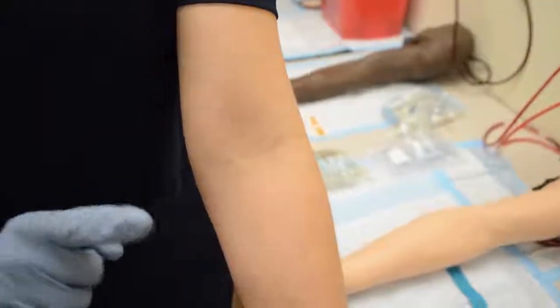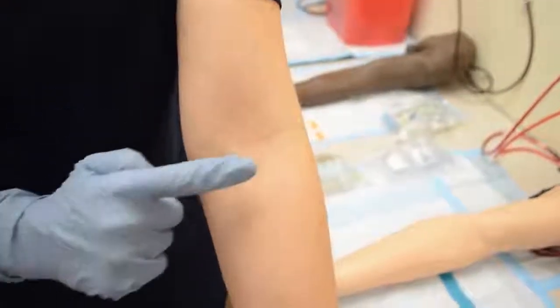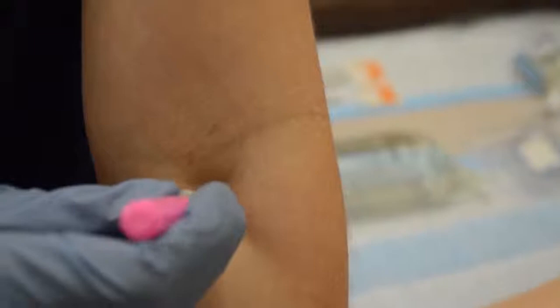Sometimes veins that we cannot see but can feel, we lose after cleaning. So before you clean the site, you can use anything that happens to have any kind of depression in it. What you can do is lightly press it up against the skin and rotate back and forth where you found the best place to poke your patient. When you remove that, you'll have a small raised area that you can clean, and it will still stay there, and you can use that as a target to aim your way.